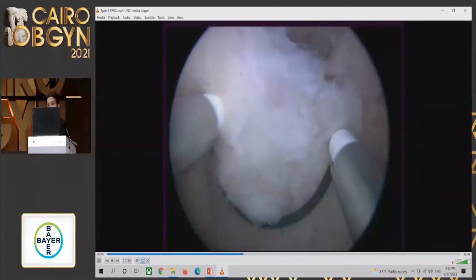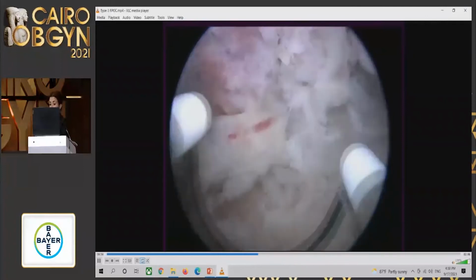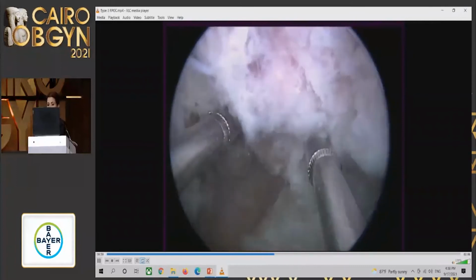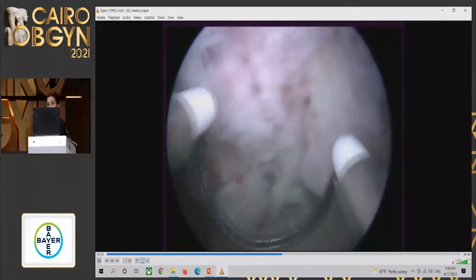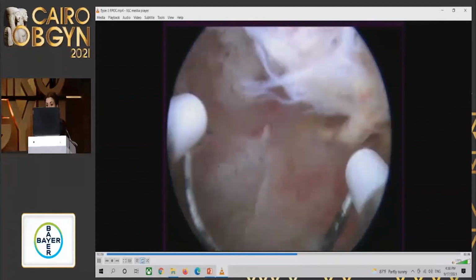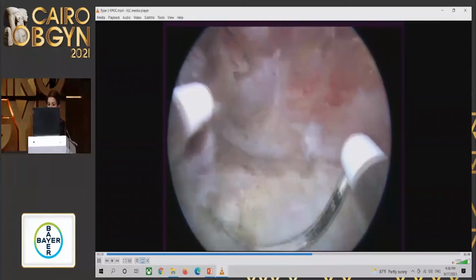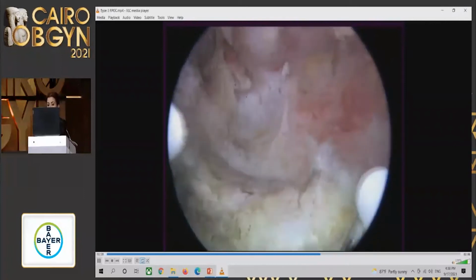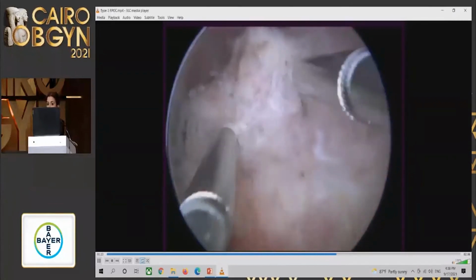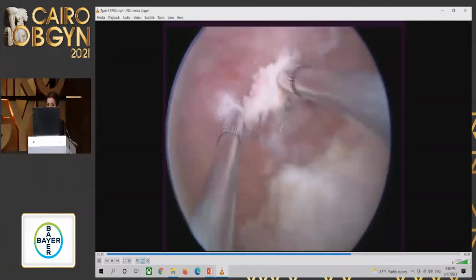So it's very important to go slowly, because there is a high risk of perforation. And if there is some bleeding, go slowly again and increase the pressure of the water. No panic, because the vessel is very big. Remember that by increasing the water pressure you can give a hemostatic pressure, and so have some help.